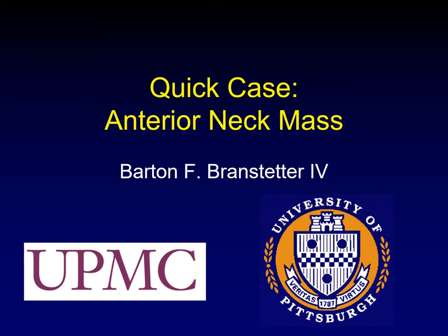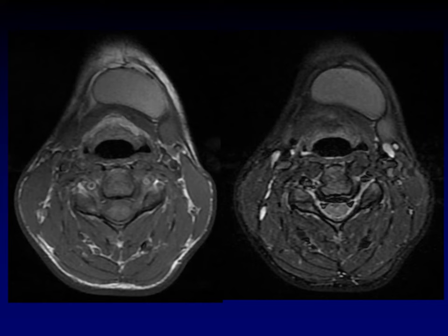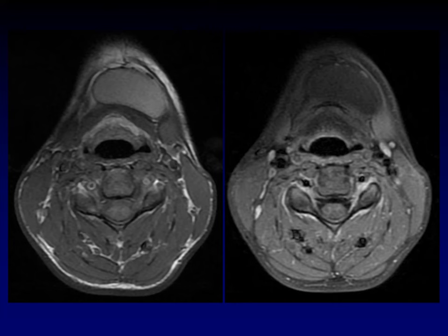It's a classic presentation: a child with a midline anterior neck mass. Here are T1 and T2 weighted sequences in the anterior neck. The mass is pretty easy to pick up here. Here is a post-contrast image. It's time to make a decision — what do you think this is?